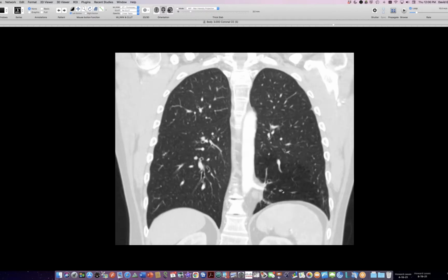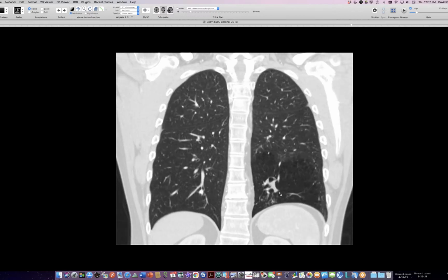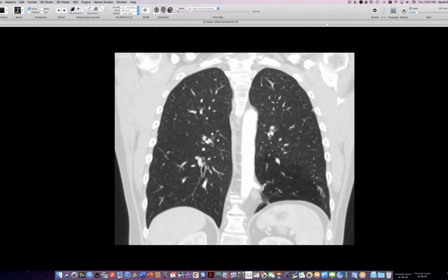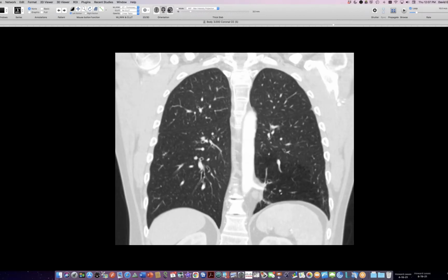Okay, that's fine. There are all these different elements that you can mix together. So it's really a question of terminology. It's definitely messed up lung. What I emphasize in teaching residents about this condition is that the term sequestration means something is isolated. And what is isolated is a normal airway communication. So these lesions don't have a normal connection to a bronchus. Therefore, the inflation of this lesion really depends on collateral drift from adjacent lung that is being aerated. So the air is getting in there from the lung parenchyma around it. It's not getting in there from a normal bronchus.